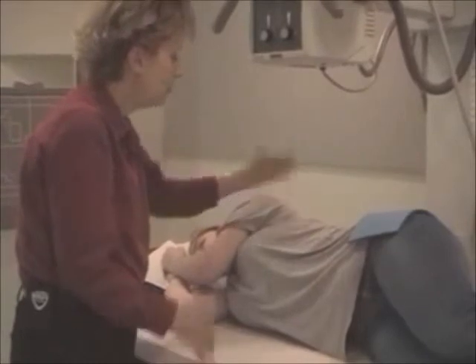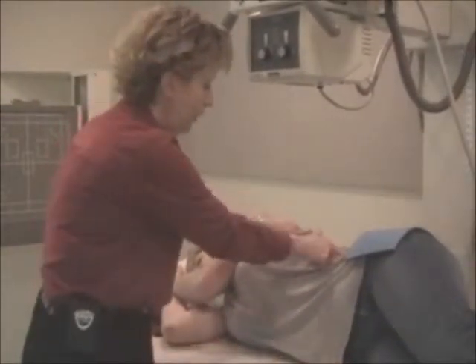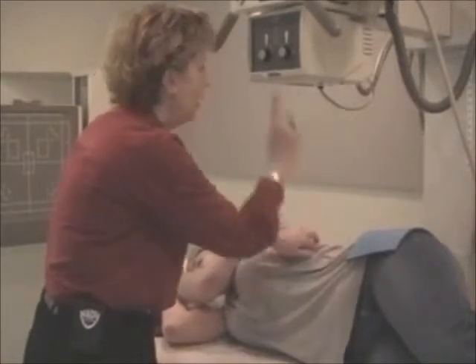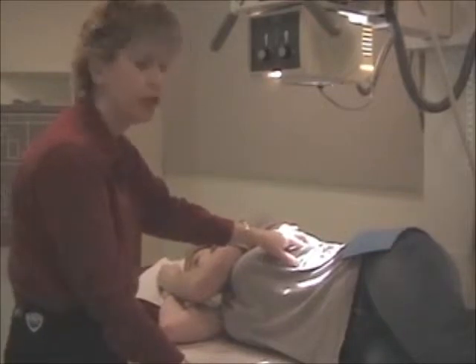Okay? Here's the crest. L3 is 2 inches above. And you can see that my halfway mark is approximately at the level of L1 or L2. Ballinger's will give you that option, that you should be centered at L1 or L2. We're giving you a more precise centering, giving you something to go for. And again, it was the tip of the scapula, iliac crest, halfway, and then a little bit below. I think I failed to tell you a minute ago that you should go an inch below.